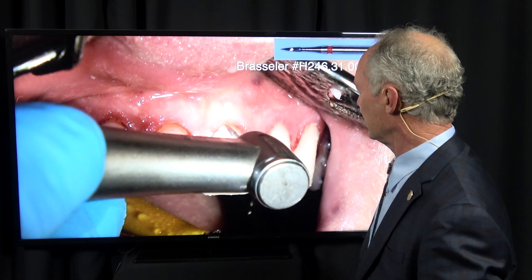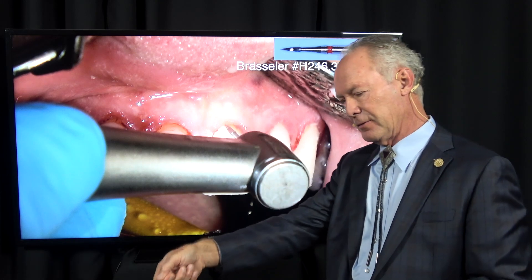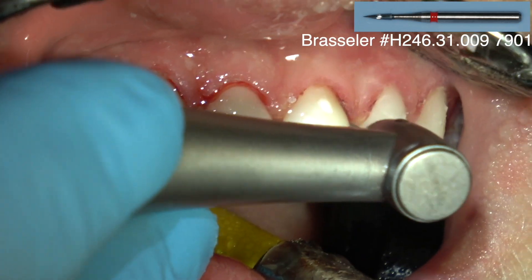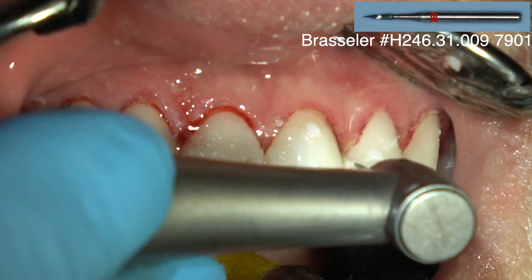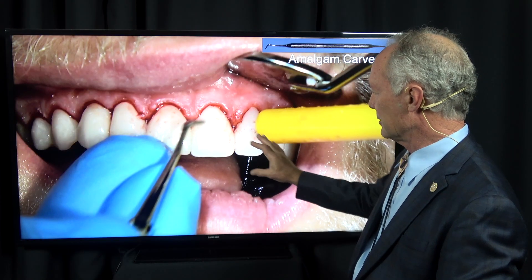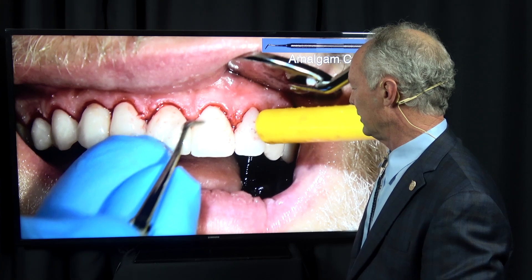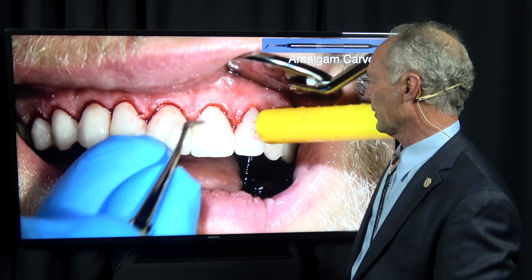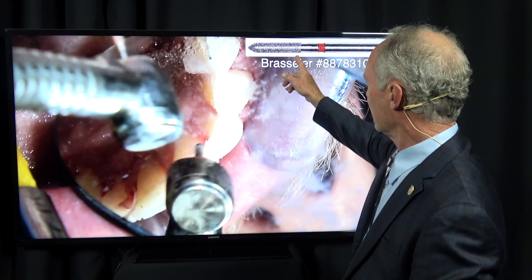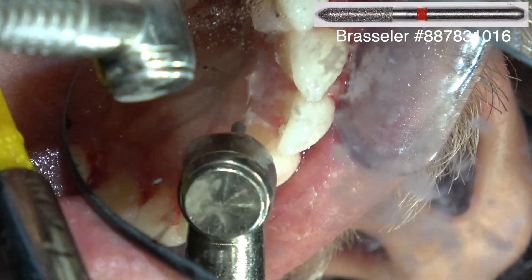Then I come back with a 12-fluted brazilier carbide bur. In the polishing direction — if you pull towards you the bur cuts; if you push away from you the bur polishes. I'm removing any little bits of excess luting composite still on there. Another hot tip: take the square end of an amalgam carver and wipe it on the facial surface of the veneers — it removes any little bits of adhesive or excess luting composite on the facial surface. Then use a large fine chamfer diamond to remove excess luting composite from the palatal surface.